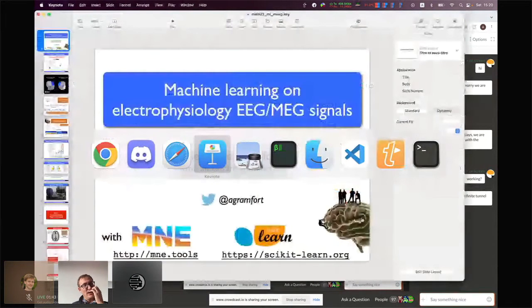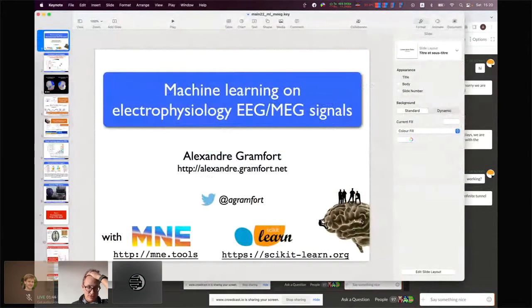I'm Alex Gramfort. I'll also be giving this tutorial with Hubert Banville this afternoon. Actually, this afternoon for us, probably this morning for many of you. And so we have a little less than 3 hours now to cover MEG and EEG data processing with a strong focus on, let's say, machine learning applications.